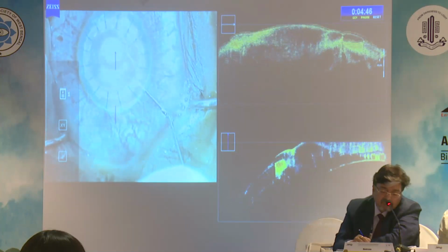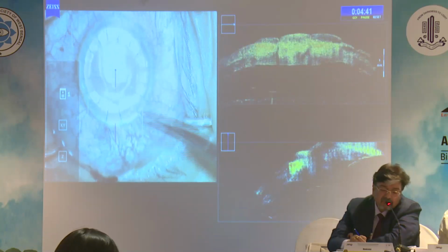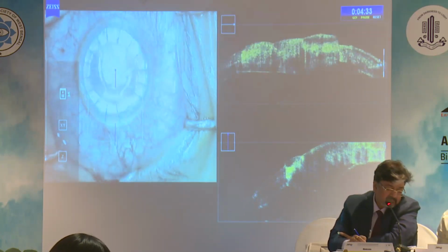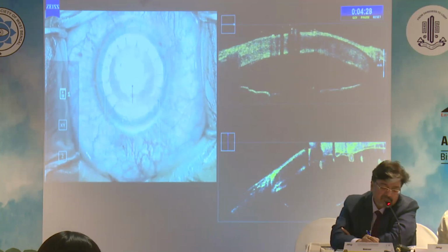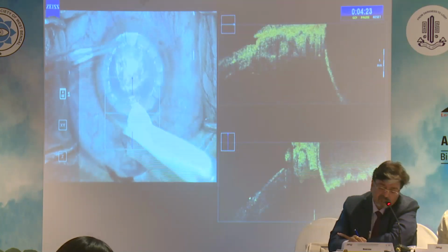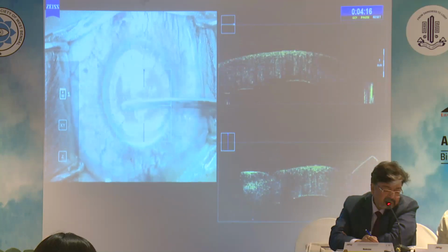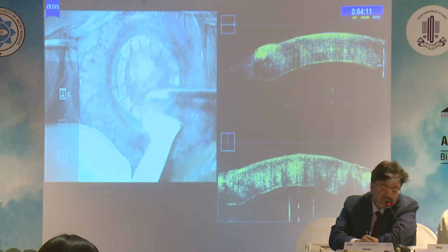IOCT-guided management of the case involved removing the sutures at the 12 o'clock position. A careful nick was then created in the pre-Descemetic layer using an MVR blade inserted via the interface, in order to remove the interface air bubble between the pre-Descemetic layer and the Descemet membrane without rupturing the Descemet membrane. Weck-Cel sponges were applied at the edge of the interface to soak the interface fluid, and gentle corneal massage with milking of the interface fluid helped achieve complete graft apposition.